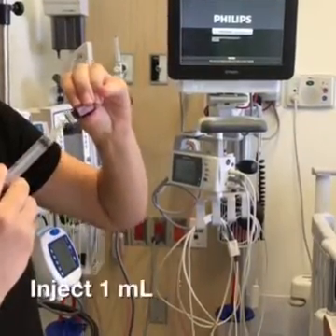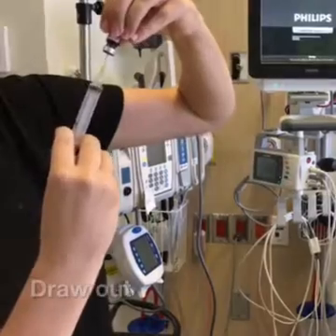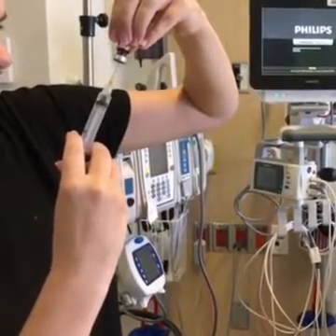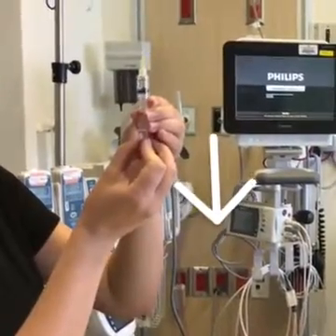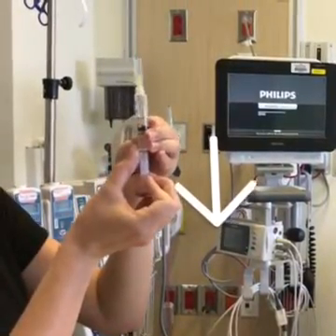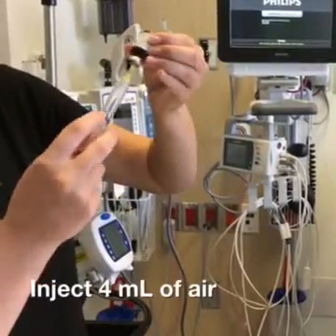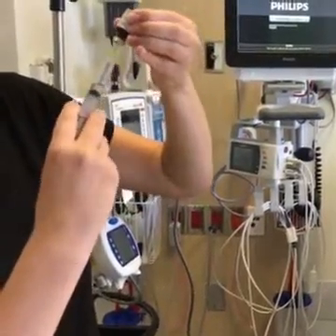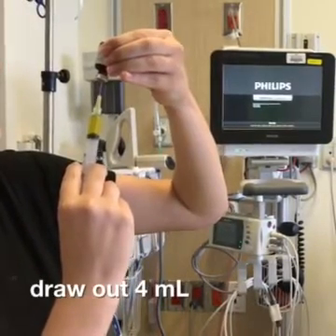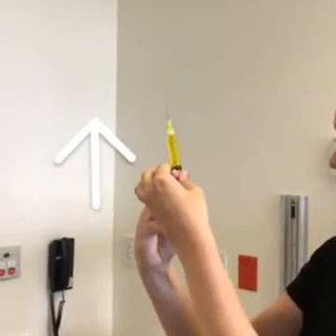Inject one milliliter of air into the first multivitamin bottle, then draw out one milliliter of solution from the vitamin bottle. Pull down the syringe plunger to the five-milliliter mark and inject four milliliters of air into the second bottle. Draw out four milliliters of solution by gently pulling back on the plunger.